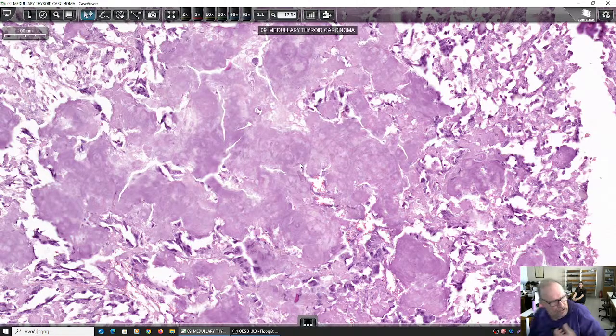This does not appear in textbooks. No, it doesn't appear in textbooks. It appears here in practice. You learn the practice, you understand my job. What do I do here? Macroscopic detection, microscopic exam, what I report, and you get this knowledge, and understand its usefulness for your patient, for your job as a clinician. This is not learned in textbooks.